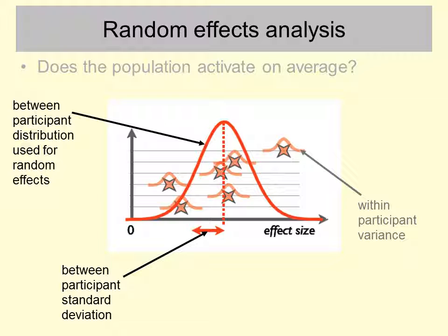within subject variance. If we do something called a mixed effects analysis, we're using both sources of variance, which is the optimum thing to do, because then you're taking into account which individual participants are giving more reliable estimates as indexed by their within participant variation, but you're also taking into account the between participant variation, which is the most important kind of variation.